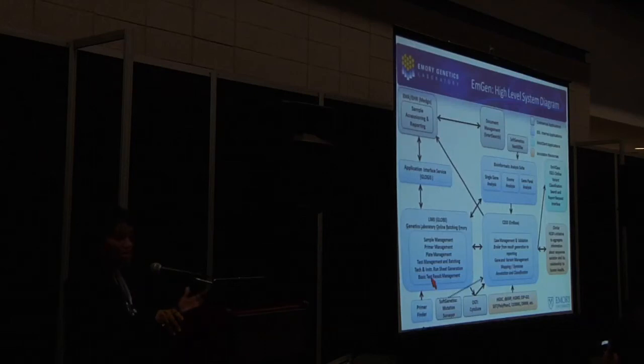We do single gene sequencing for more than 1,000 genes, but essentially we do get a lot of requests where an exome has been performed somewhere and one variant is reported in an autosomal recessive condition, 2 or 3 exons dropped out, and the physicians want those exons completed. So this is a custom assay I'm talking of.